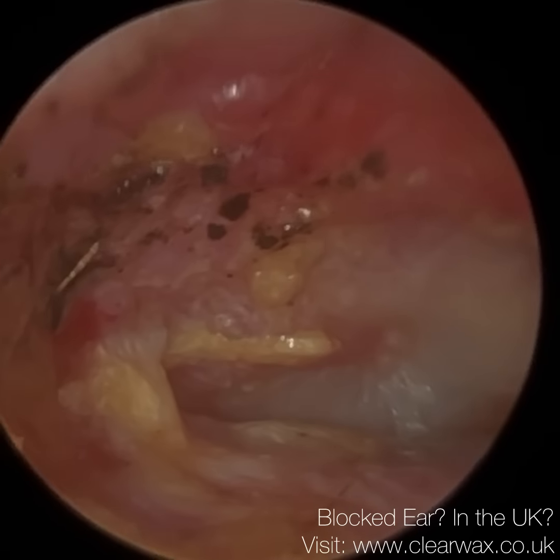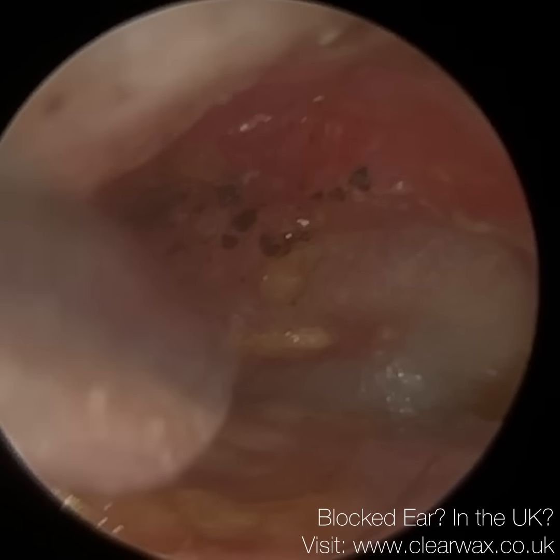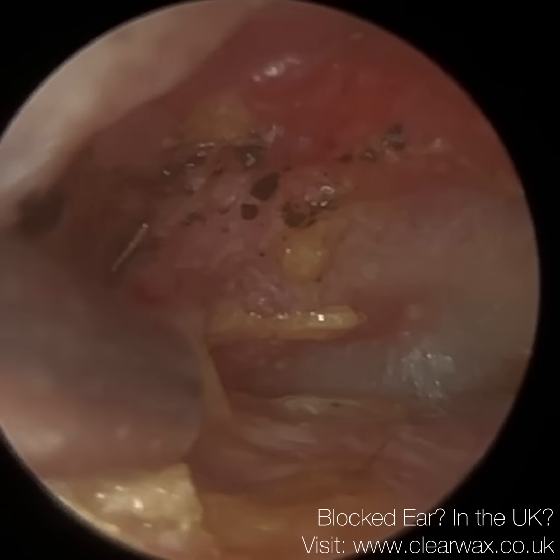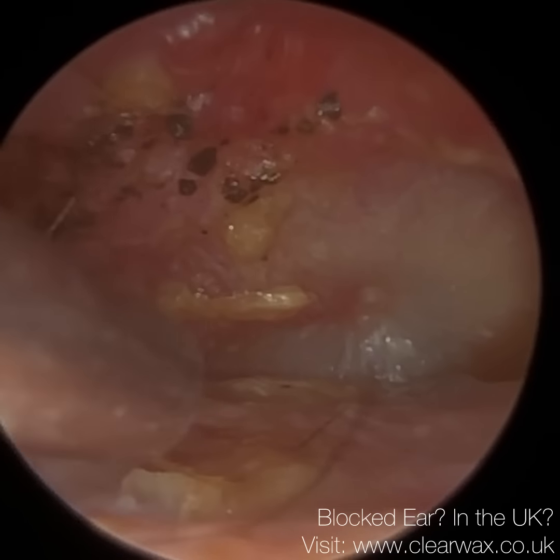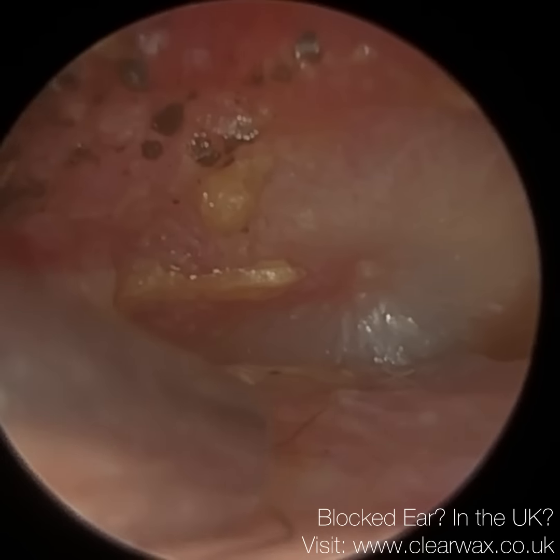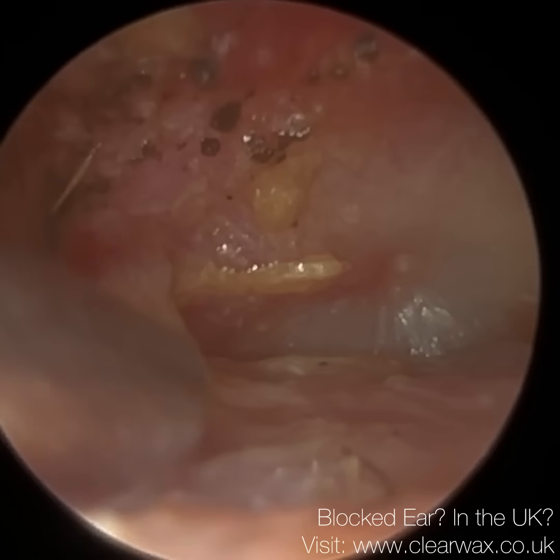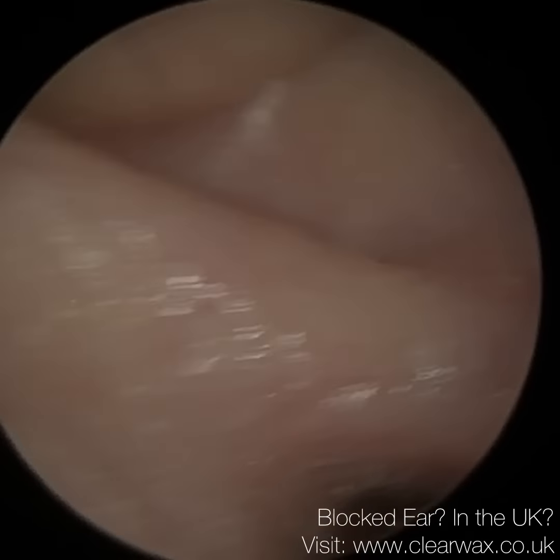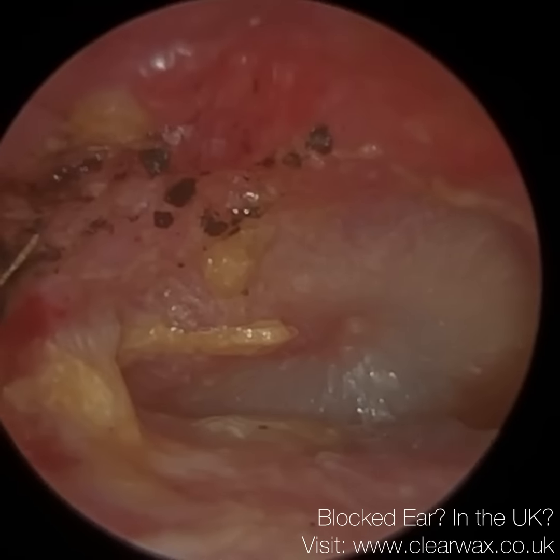So it's safe to say this patient experienced significant relief of their symptoms. There's a bit of granulation tissue just at the roof there as well. So I'm just trying to glide the suction tip across the surface of the canal wall with minimum friction, so it's not uncomfortable for the patient. And trying to separate this layer of skin. So it's quite angry, it's quite tender in there.